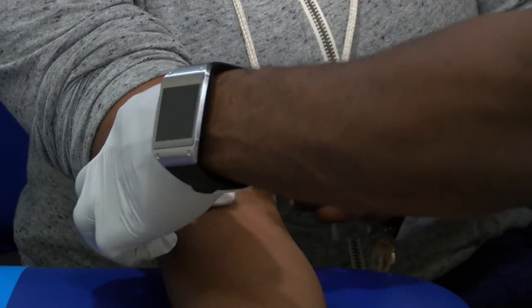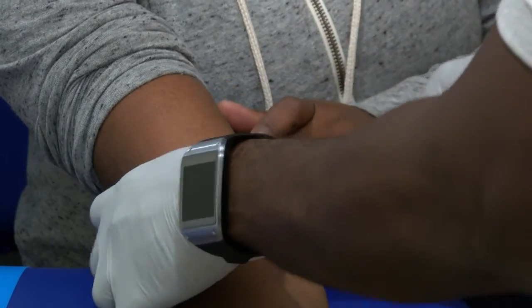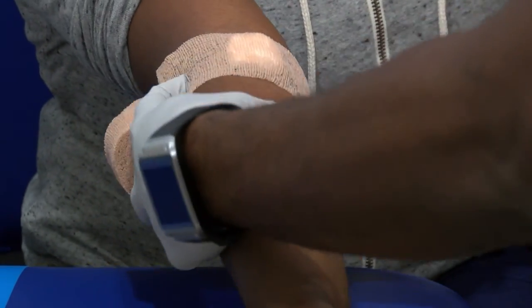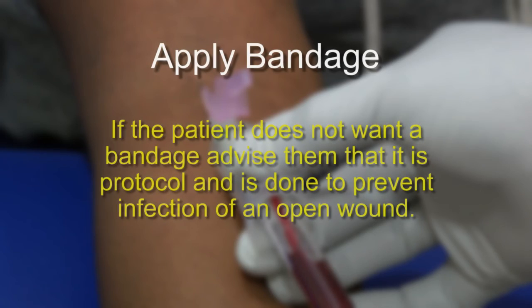Okay, it looks pretty good. It doesn't hurt, right? No. Okay, perfect. Just mark with this. Put your arm up to me just a little bit. If the patient does not want a bandage, advise the patient it is protocol since there is now an open wound and the purpose of the bandage is to prevent infection.